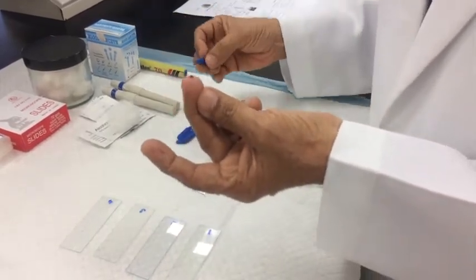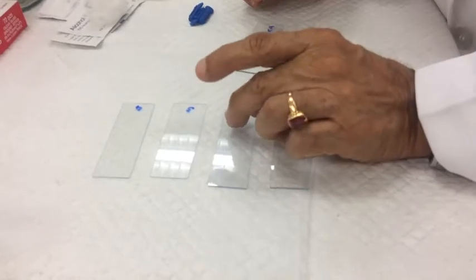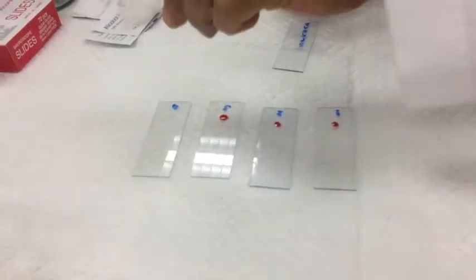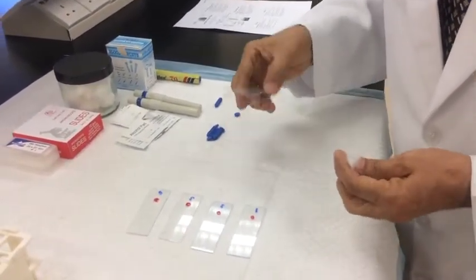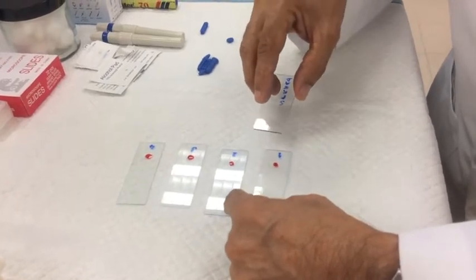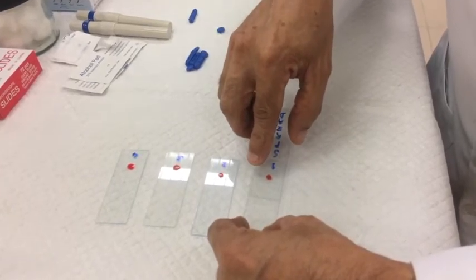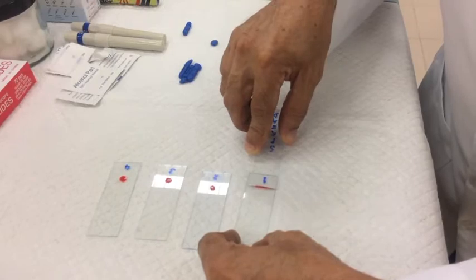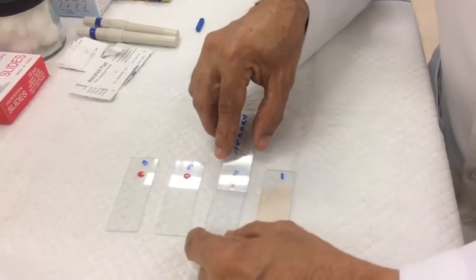The blood sample is obtained and transferred onto the slide. Place a drop here and another sample over there — that is all that is required to make the slide. Hold the slide firmly on the table, place the spreader slide in front of the blood drop, bring it backward to allow the blood to spread, then move it forward with uniform pressure.